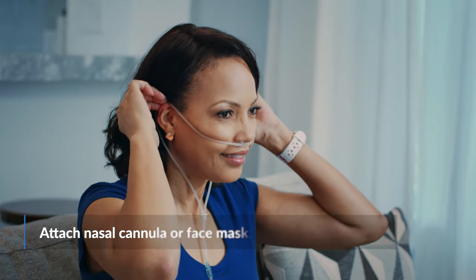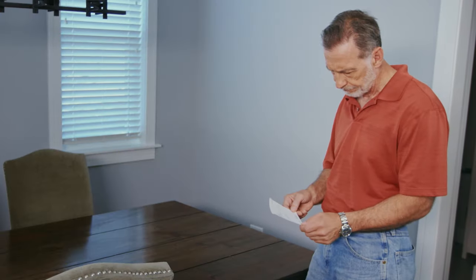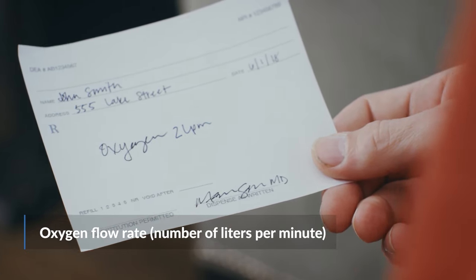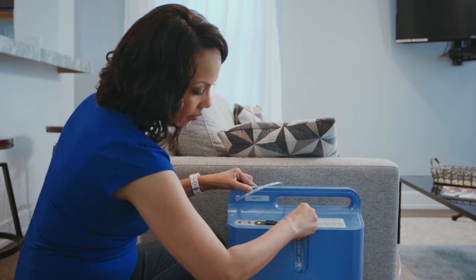Next, attach your nasal cannula or face mask and set the rate, which is prescribed to you by your doctor. You will notice the oxygen is prescribed in number of liters per minute. The flow rate, or number of liters per minute, is your prescription. Do not self-adjust your oxygen flow rate without consulting your doctor.